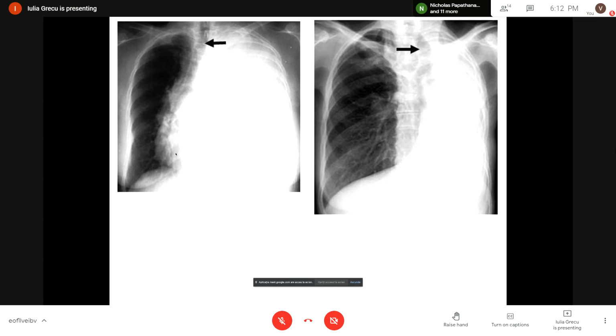So this is how you basically put the diagnosis if you want to determine whether the fluid is an exudate or a transudate, whether it's hemorrhagic, whether it's neoplastic, or what kind of cells and other biochemical components it has. But when you see a chest X-ray, we have to establish the easy parts. What is the diagnosis? Is it a pulmonary opacity, is it pleural or parietal, and so on and so forth? So I hope you understand what I asked.